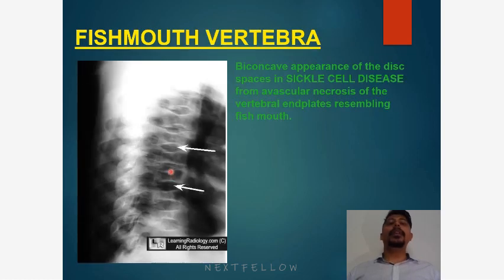Fish mouth vertebra. It gives a biconcave appearance of disc spaces in sickle cell disease from avascular necrosis of vertebral end plates resembling the fish mouth.